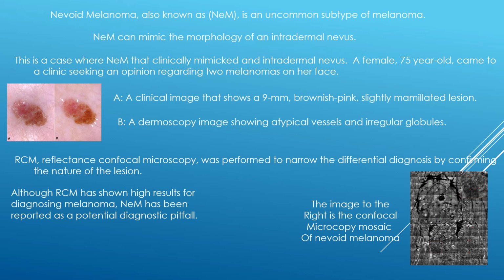But it does show that although RCM has shown high results for diagnosing melanoma, NEM has been reported as a potential diagnostic pitfall for other things. So it's not always a great diagnostic on all things. So that is one of the bad things of it.